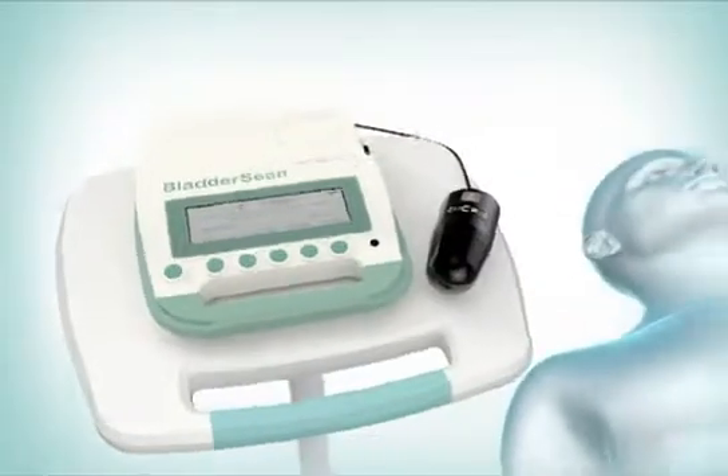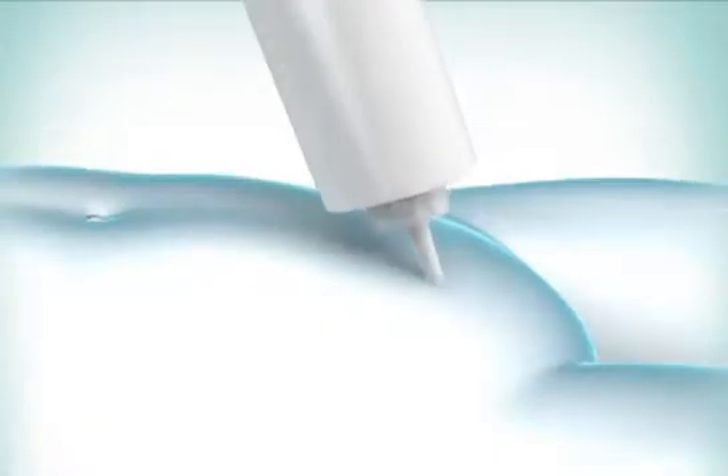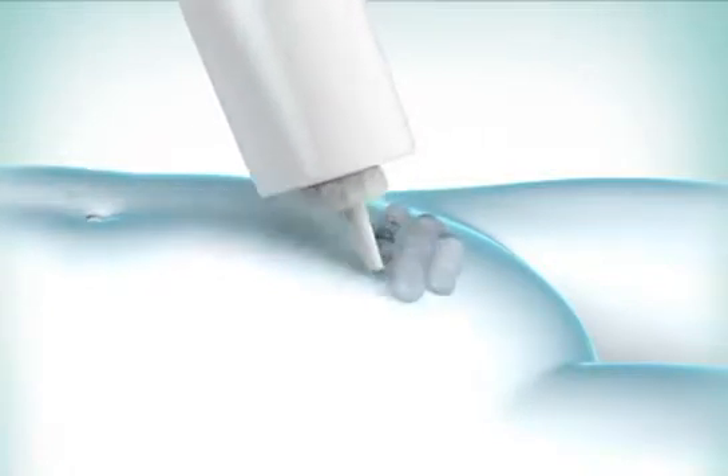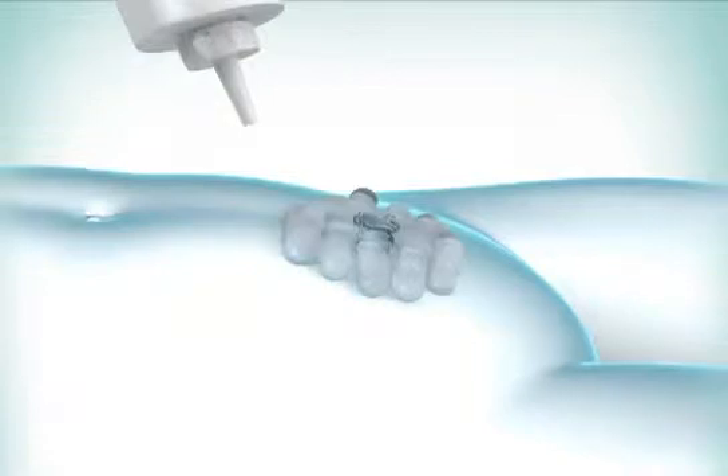Have the patient lie in the supine position. Palpate the patient's pubic bone and place an ample quantity of gel midline on the patient's abdomen, about 1 inch or 3 centimeters above the pubic bone.